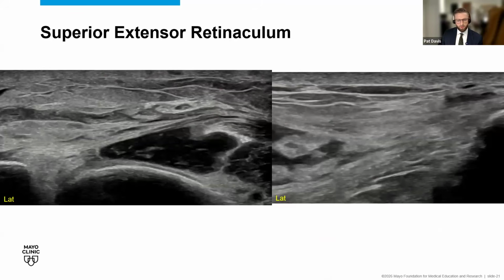Now, that was more towards the center of the ankle, not necessarily extending out to the actual attachments of the retinaculum. So it's important to assess the attachments as well. This could be a site of potential additional pathology, and certainly you could suffer an avulsion of this retinaculum, whether it be more laterally on the fibula or on its tibial attachment.